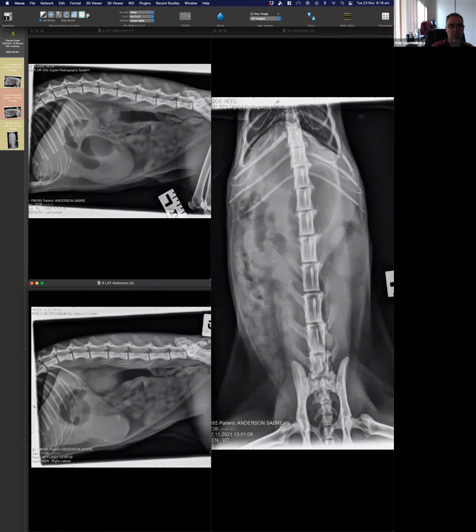So the stomach is a complex structure. When Helen pointed to this, I agree with all of these. The part that I disagree with is that I would expect the other side of the stomach, the left side of the stomach, to go up, and then all of that. So the stomach in the lateral projection has a left-sided component, a right-sided component, and the body. So it doesn't stop here. And you can see that here.